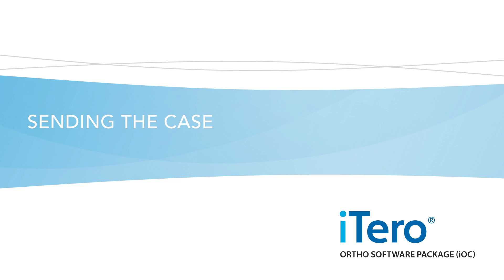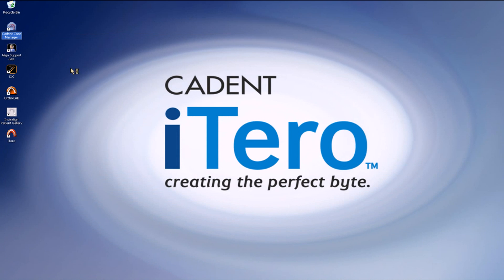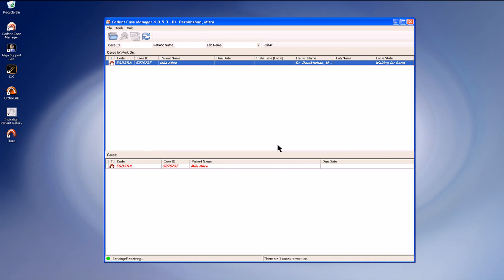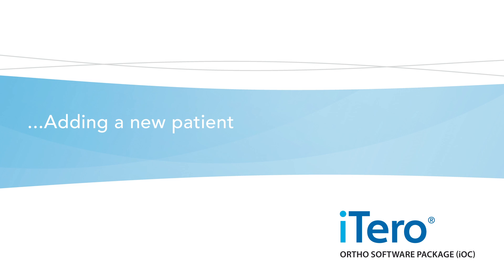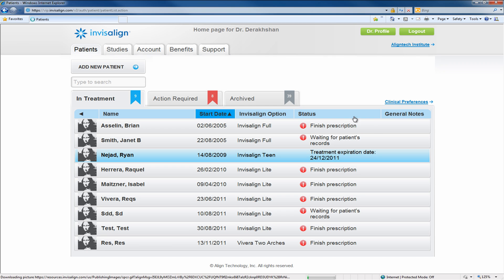Sending the case. After all areas of the model are captured, you can press the send button and the case will be sent immediately. Once the software is closed, open the case manager and verify that the scan was sent. After you submit your completed Invisalign scan, wait about 15 minutes before submitting your Invisalign order. There will be two different ways you can upload the scan into the patient data.